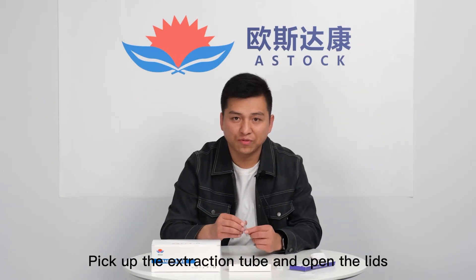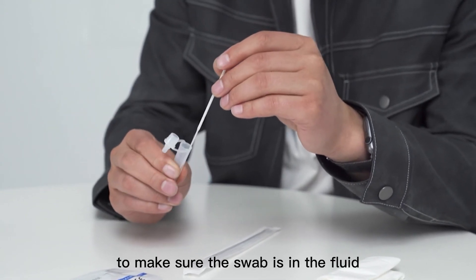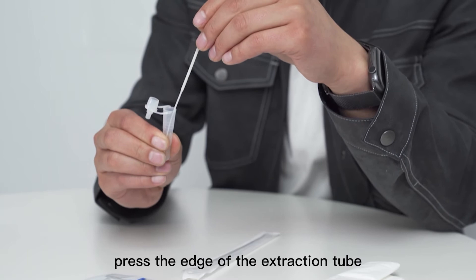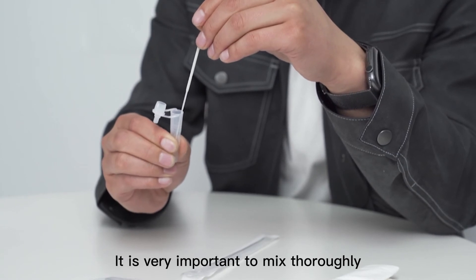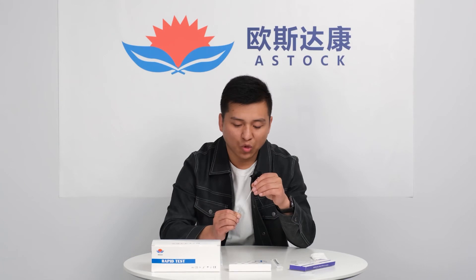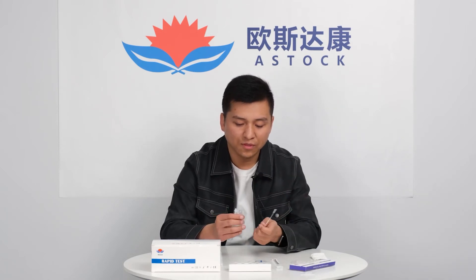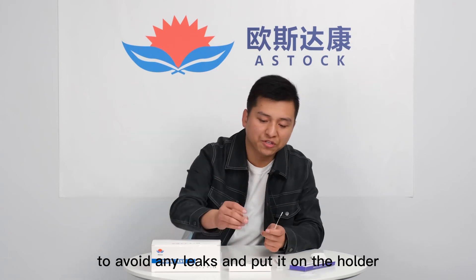Pick up the extraction tube and open the lid. Put the swab into the tube, making sure the swab is fully submerged. Press the edge of the extraction tube firmly — it is very important to mix thoroughly. Please roll it around for about 15 seconds. Then remove the swab and press the tube to make sure all the liquid is squeezed out. Press the cap to seal it and put it on the holder.